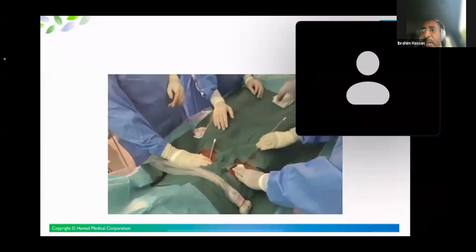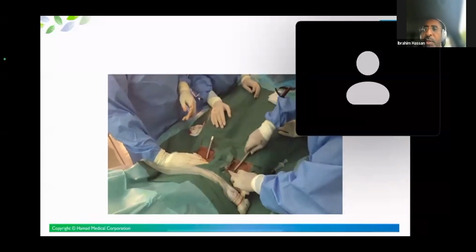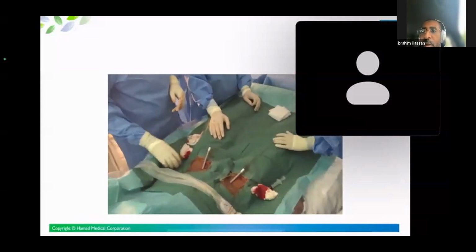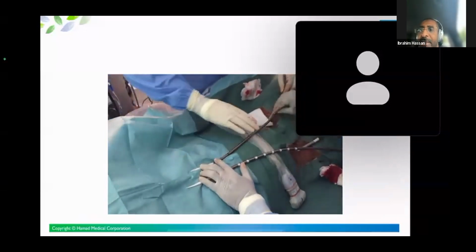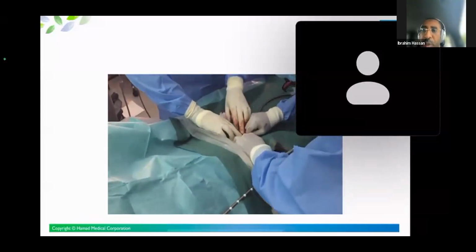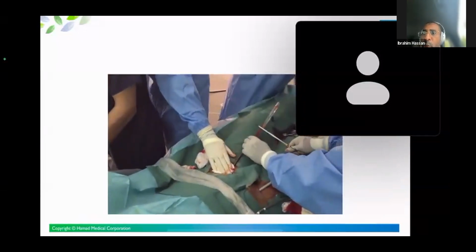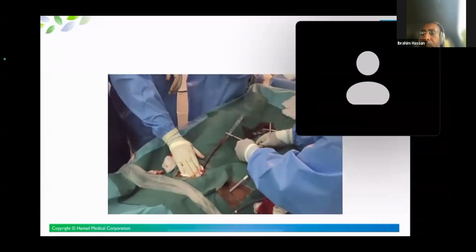This was at the bedside in the trauma intensive care unit, with an ECMO consultant on the right and a trauma surgeon on the left, working together with ECMO nurses, trying to establish the access. And now these are the cannulae. One is the access that has multiple stages, and then the drainage and the return, which they are placing now. Once you place it, you flush it and make sure it doesn't get clotted, as you can see in this video.